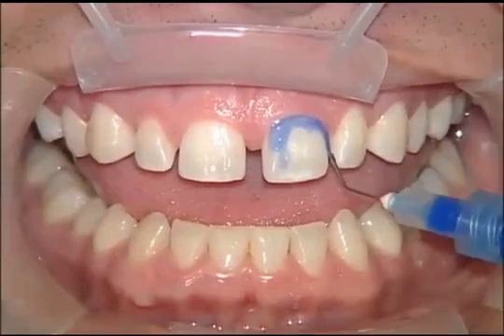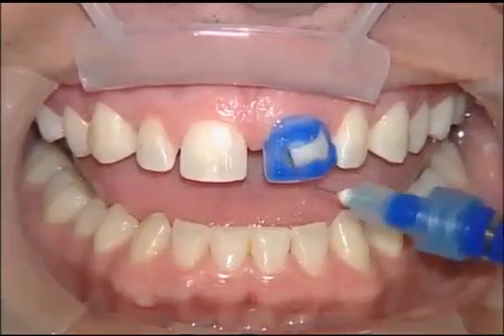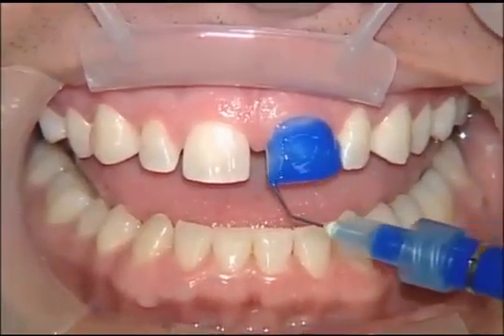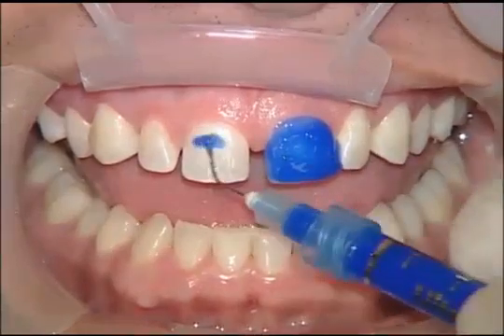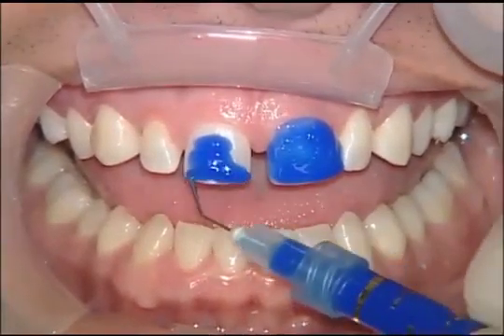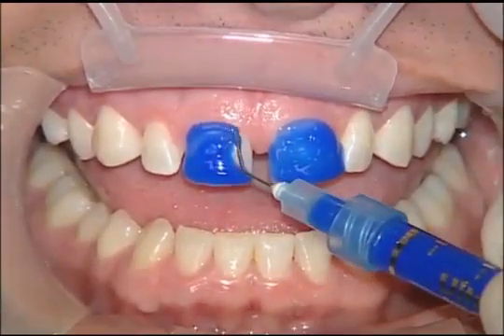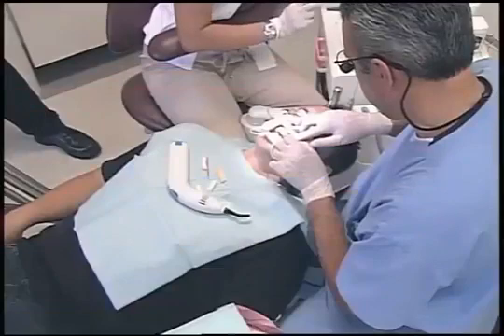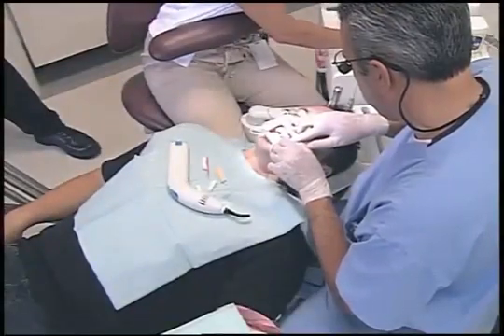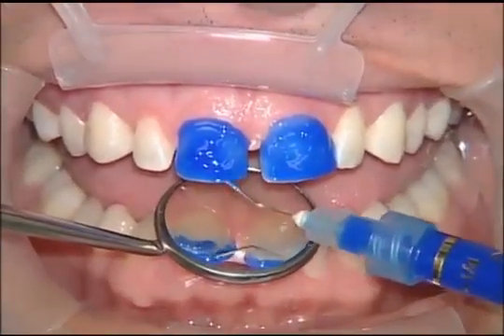We're going to go ahead and begin the etching procedure with a 37% phosphoric acid. One of the other nice things about no prep veneers is when you prep veneers and you have had temporaries on for a couple of weeks, the gingiva can get irritated, and the acid etch can actually make the gingiva bleed. Typically for no prep veneers, we have very healthy gingiva because there's been no prepping and no temporaries that have been in place. And as a result, we have the opportunity to go ahead and place the etch next to some healthy gingiva so we don't have to worry about bleeding.